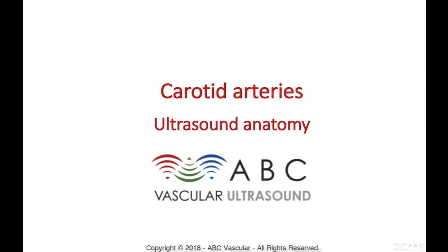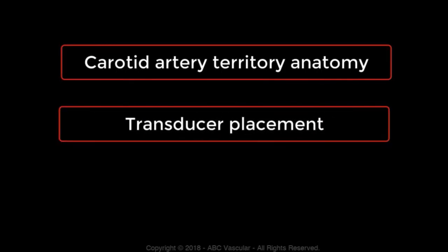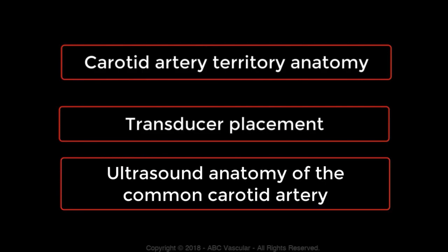Hi, and welcome to this ABC Vascular Ultrasound video lecture on ultrasound carotid anatomy. In this video lecture, we will talk about the anatomy of the carotid arteries, positioning of the transducer for the identification of the carotid arteries, and the ultrasound anatomy of the common carotid artery.